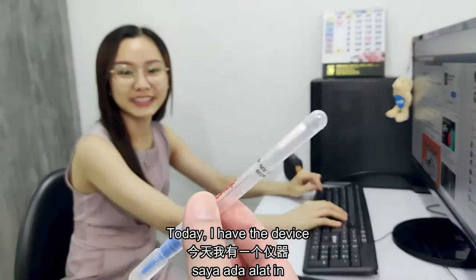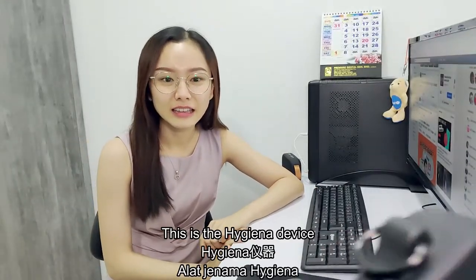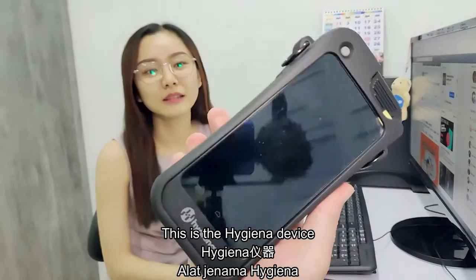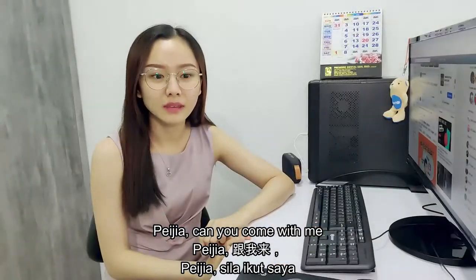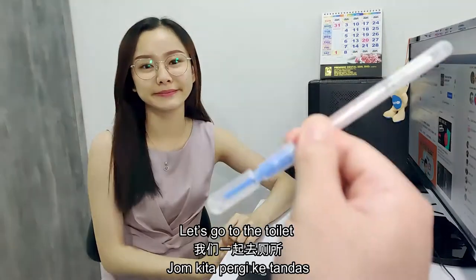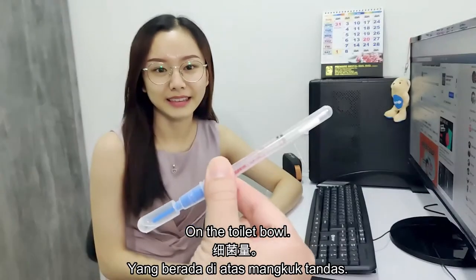You know why? Today I have the device — this hygiene device for us to test the bacteria count. Peja, can you come with me? Let's go to the toilet and we'll test the bacteria count on the toilet bowl. Let's go.